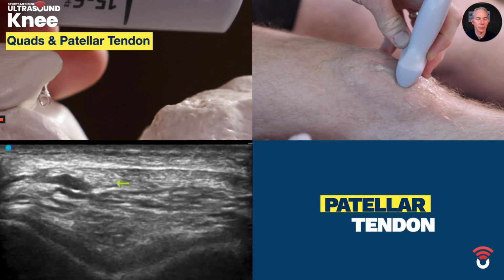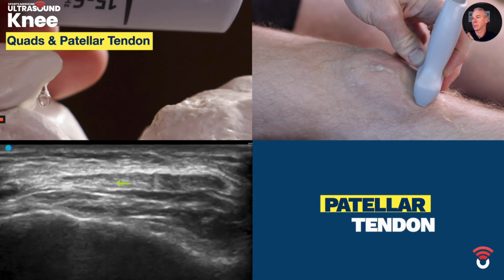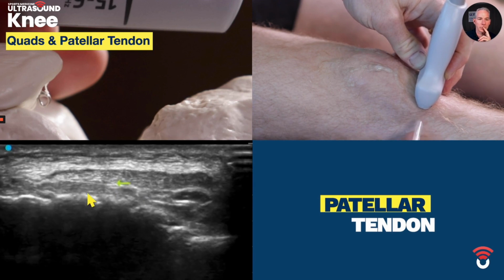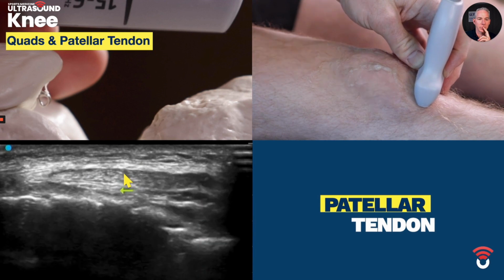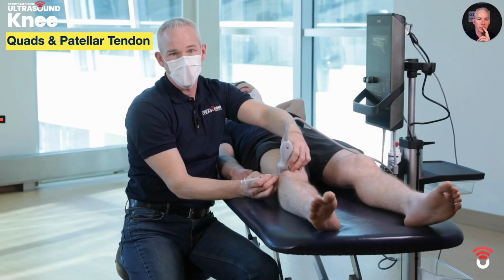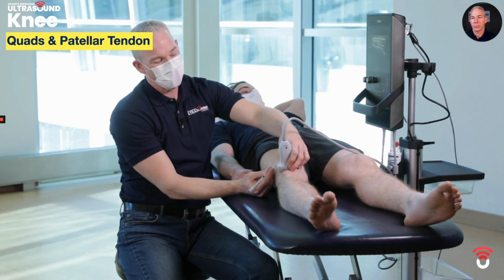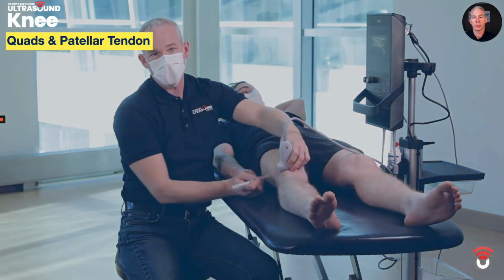For distal patellar tendon pain, I would simply slide distally, and I would do the same thing. For PRP, I would go in the tendon like this, and for cortisone, I would go deep to the tendon like this. And that's how I would scan and inject the quadriceps tendon, the proximal patellar tendon, and the distal patellar tendon. Well, excellent. It's now time for the quiz.